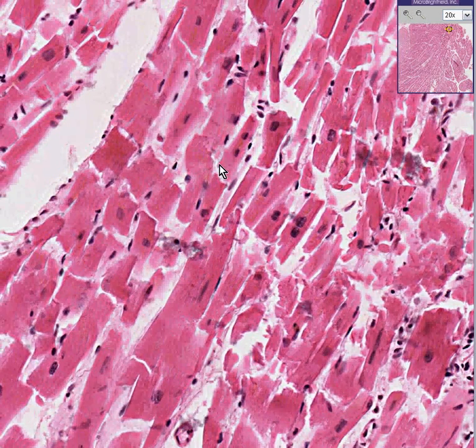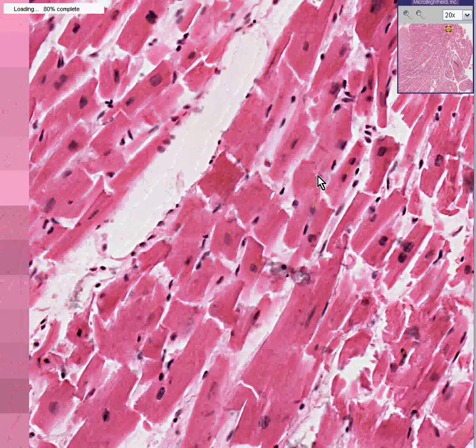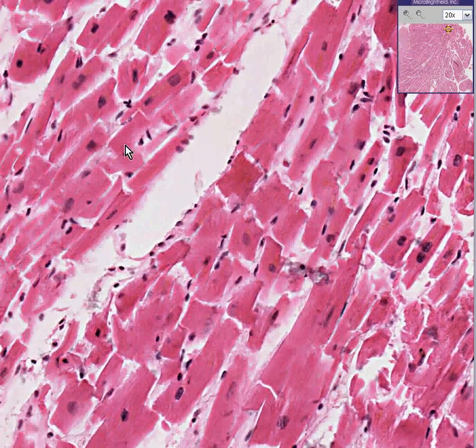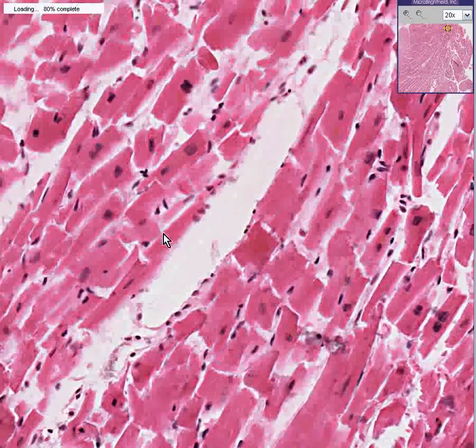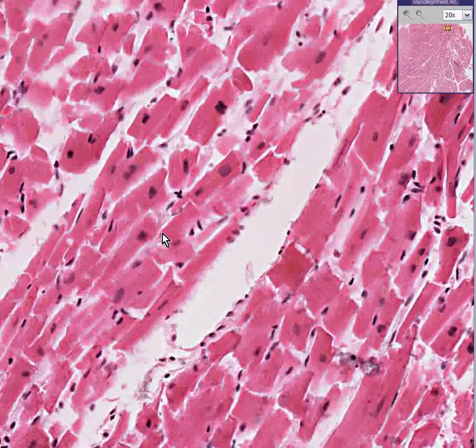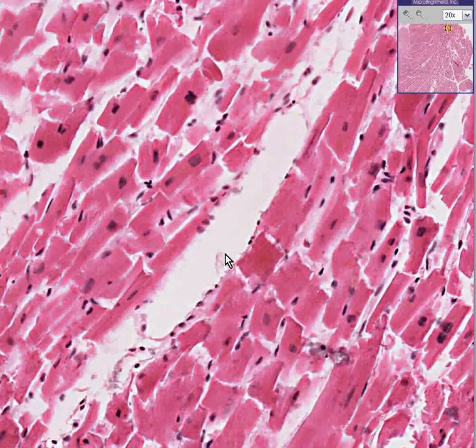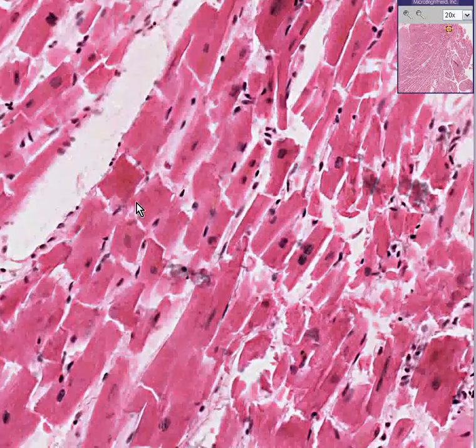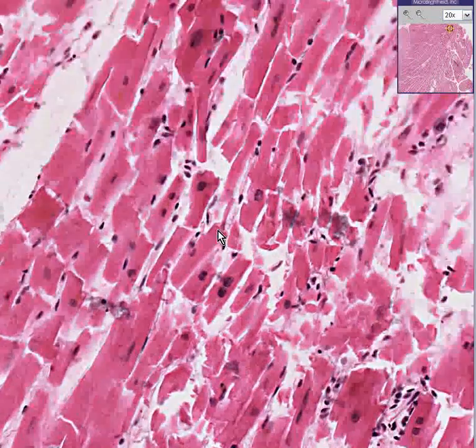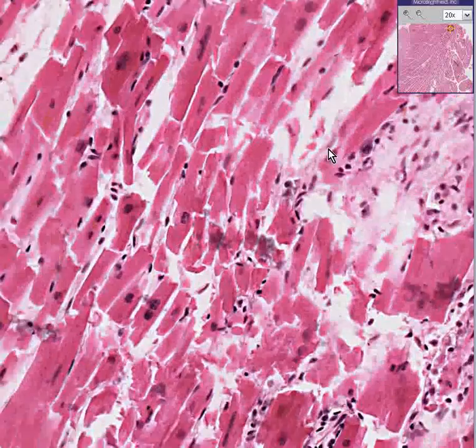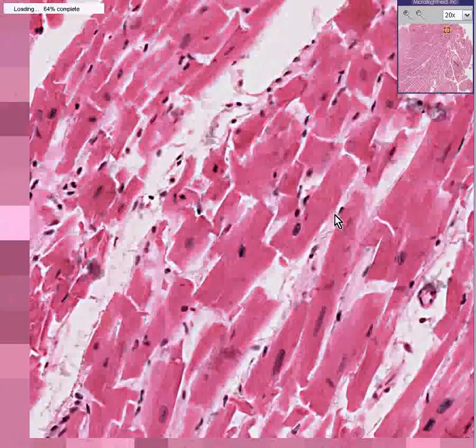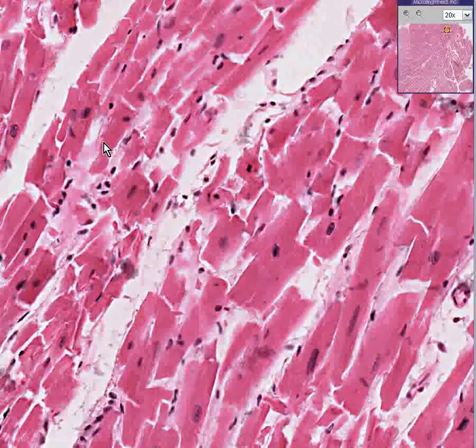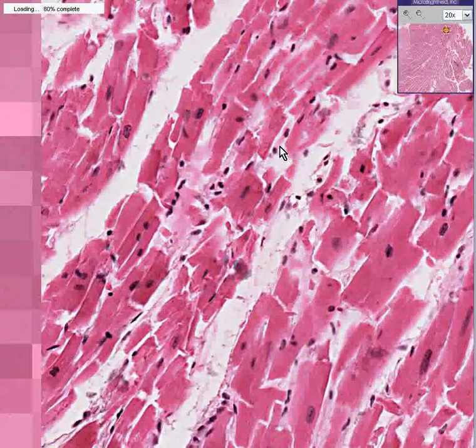Let's see if I can find some striations for you. I don't see too many good ones myself, but you don't always see them. Notice that in areas like this, the muscle looks pretty good.